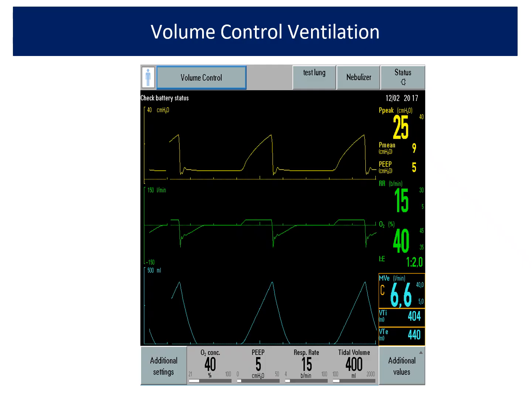For example, in this patient, you can see that there is a constant flow pattern, then inspiration has switched to expiration, and this is where expiration has completed. But then you can see that there is a small dip in the flow during expiration, and you can also see that there is a small dip in the pressure post expiration. It looks like the patient is trying to take an extra inspiratory effort. So what happened here is basically the patient wants more inspiratory time, but you are not giving that much inspiratory time. So this is called cycling asynchrony. Probably by looking at it you know that it's cycling asynchrony, and probably you have to increase the inspiratory time.